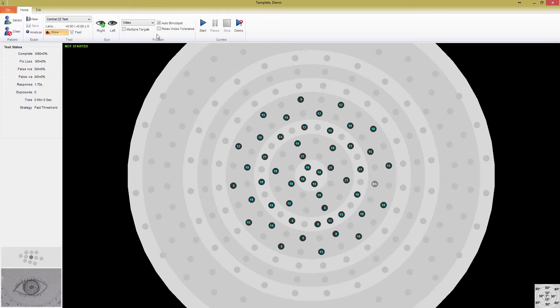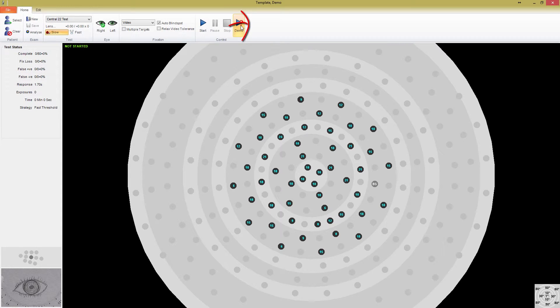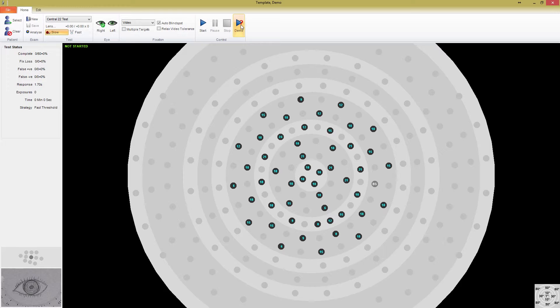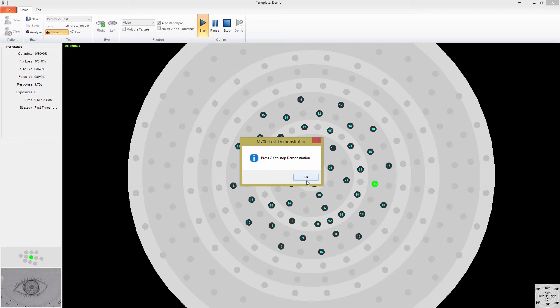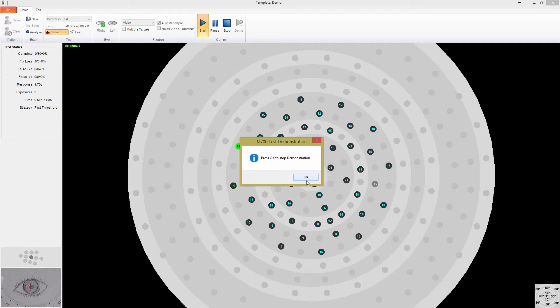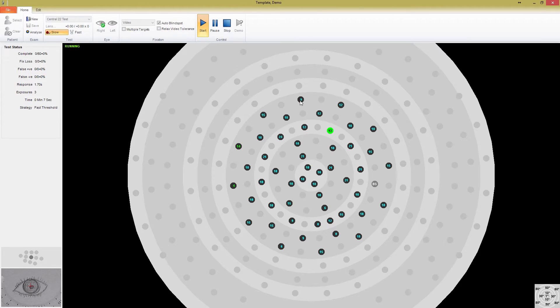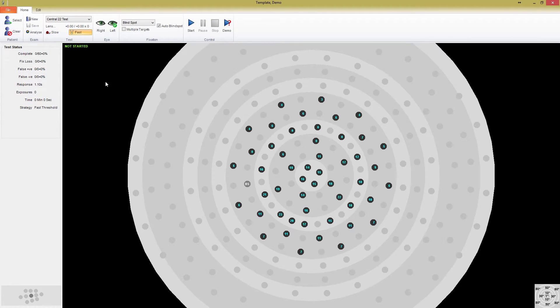One more feature in the top panel that we haven't discussed is the demo button. When you press the demo button, the test will begin in a demonstration mode. This appears the same as a normal test to the patient, but none of the data is stored. It can be useful for showing your patient how the instrument works and what they can expect. I'm going to swap over to an exam using the simulator so I can run this exam while I'm talking. If you look at the test status box on the left, you'll see data that updates as the test progresses. Everything is currently set at zero until the test starts.